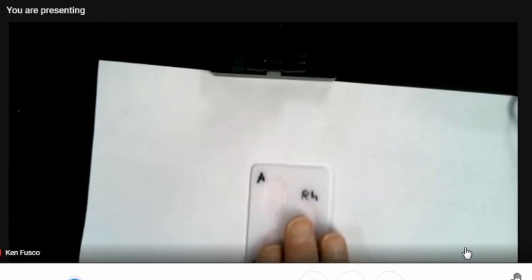Okay. I have 4 patients. I'm going to take blood from each patient. It's simulated blood, and it's simulated anti-serum. But I have blood from 4 patients. I'm going to put a drop of blood for patient 1, 2, 3, and 4 on this well plate.